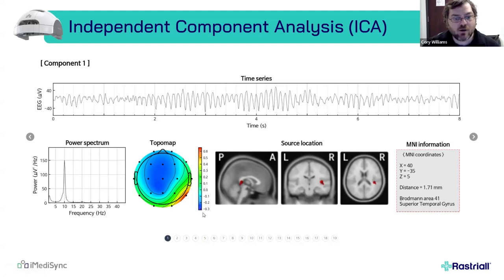It's primarily alpha. Where does it occur in the brain? And 3-dimensionally, where does it occur? So this is looking at one component that's made up of multiple rhythms in a 3-dimensional shape. So this is, as far as I'm concerned, about as advanced as you can get when it comes to trying to analyze what is happening in a brain in real time.